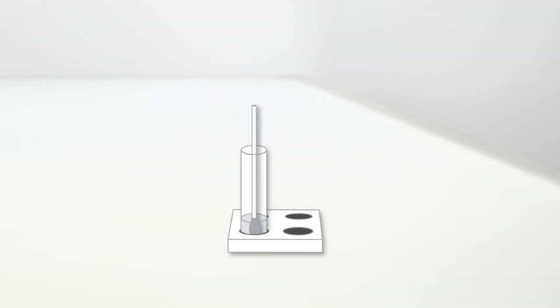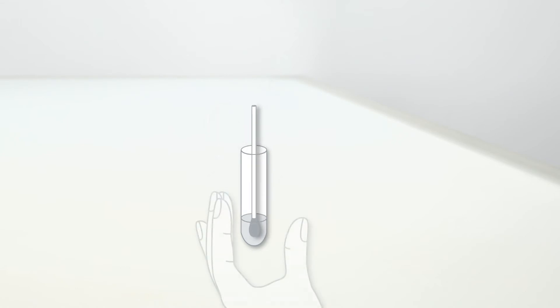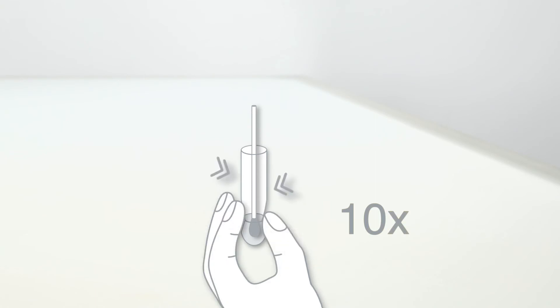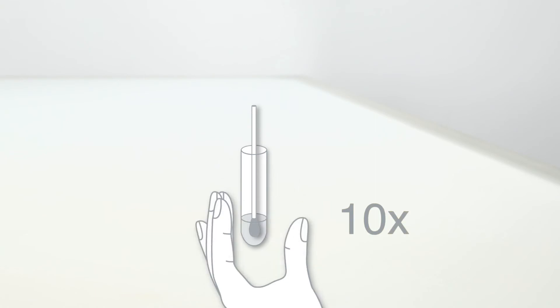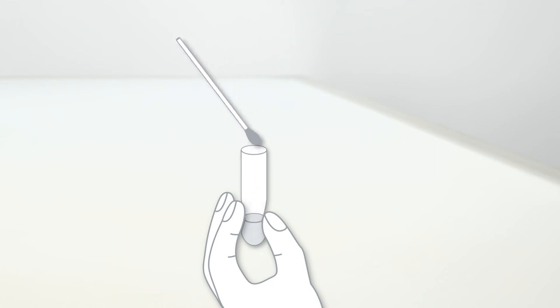Insert the swab with the collected sample into the tube. Swirl the swab and press the tube approximately 10 times, applying light pressure to the tip of the swab. When you remove the swab, press the sides of the tube together to extract as much liquid as possible.